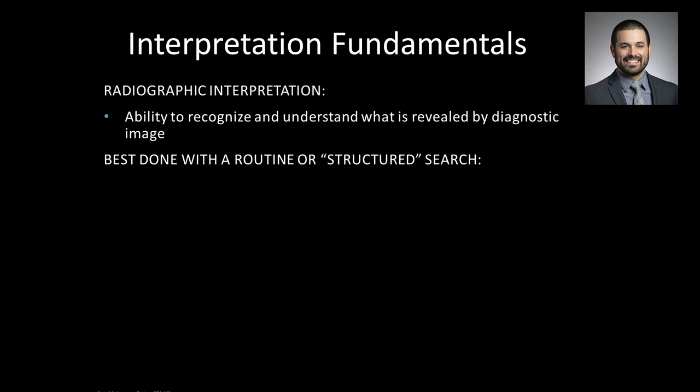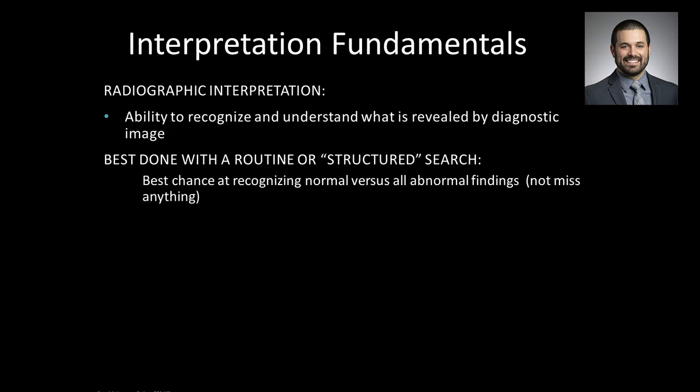I do every cone beam CT that way all the time. The reason is that I have the best chance at recognizing normal versus all the abnormal findings and not missing anything. The big fear with all this data is that I don't want to miss anything, and the best chance of avoiding that is using a structured search.